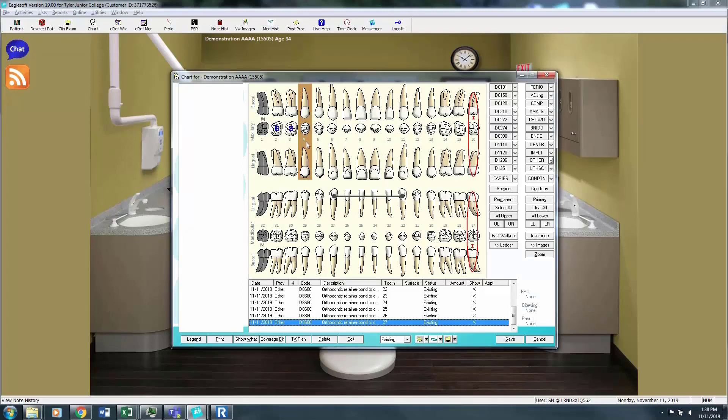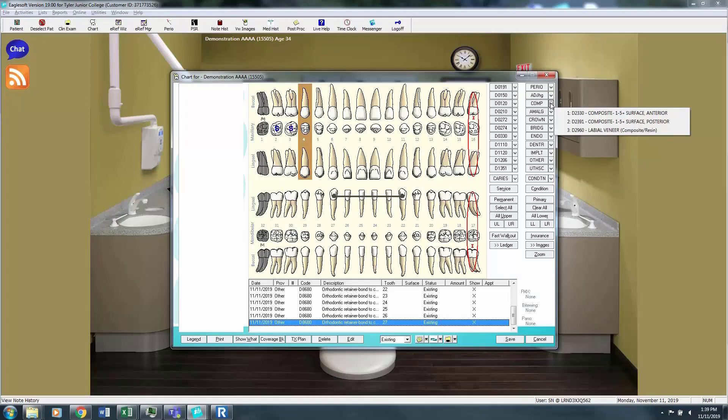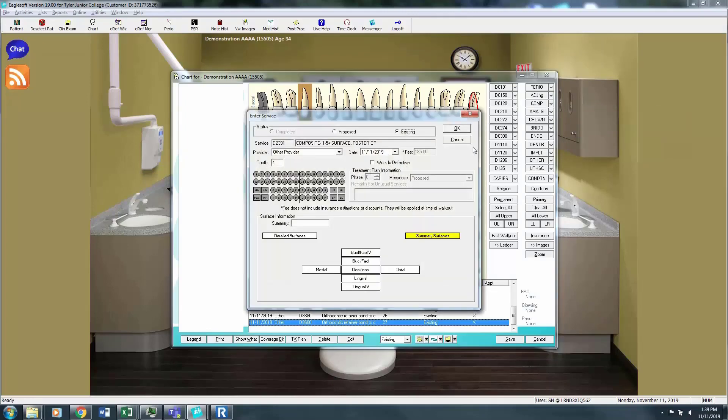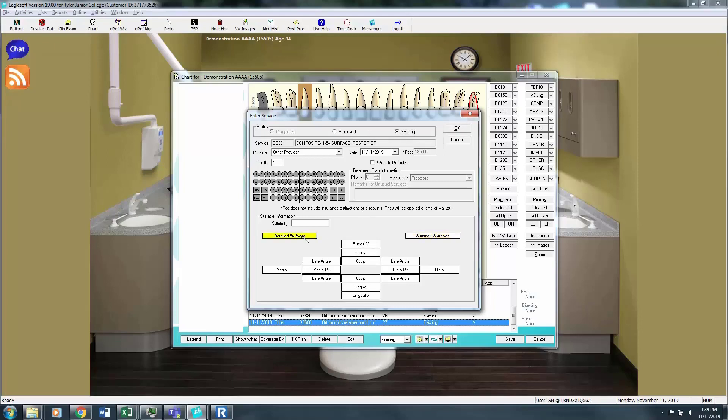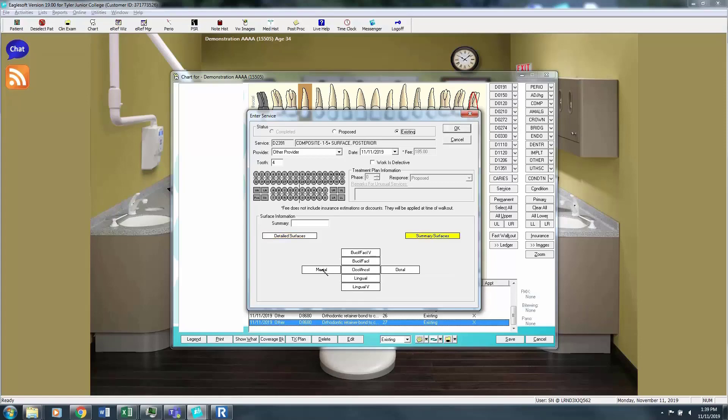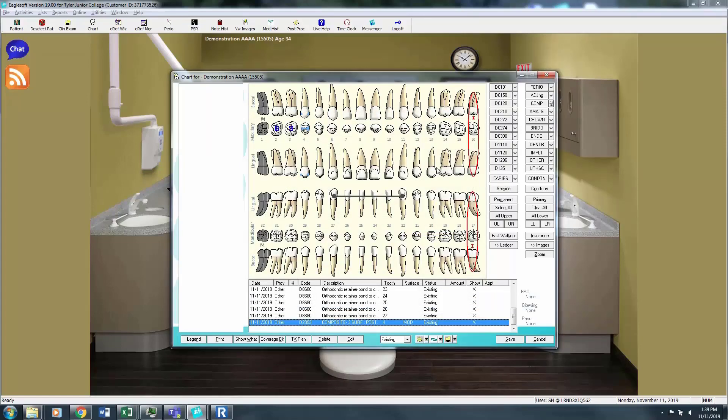Alright, now let's play with each one of the tabs. We're going to say tooth number 4 has a composite. So I'm going to choose that that is a posterior tooth. And here I get to choose, am I proposing treatment, which we do not do here at TJC, or is this treatment existing? Click detailed surfaces and see how detailed you can get with the fillings. Ideally we have the filling looking exactly like it does in the patient's mouth. So we're going to say tooth number 4 has an MOD existing.